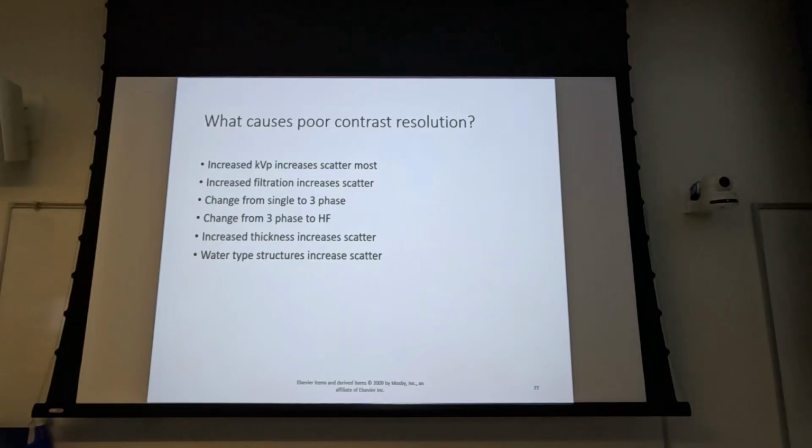So DR, again, is as fast as screens and films, potentially even faster. So what we did was, instead of decreasing the kVp back down, we just decreased the mAs. Okay, and we haven't seen any kind of real effect on contrast. So could we do it again? Increase kVp by another 15%, cut our mAs in half?